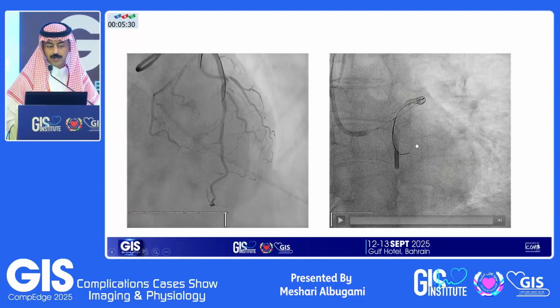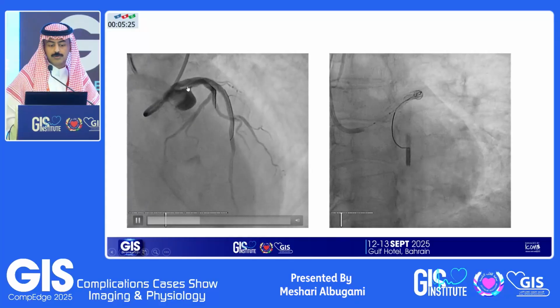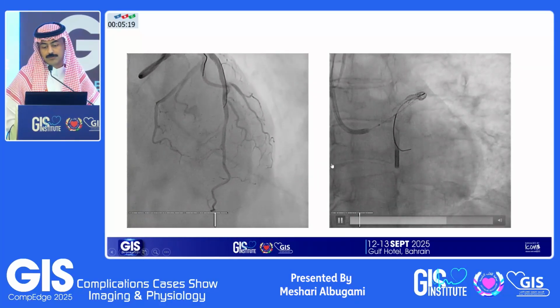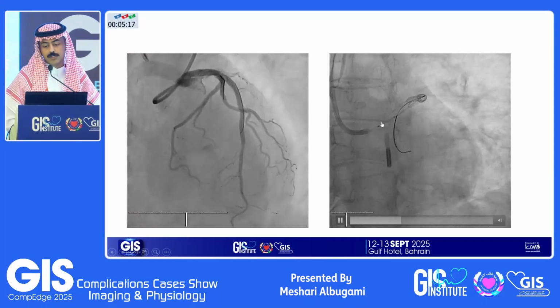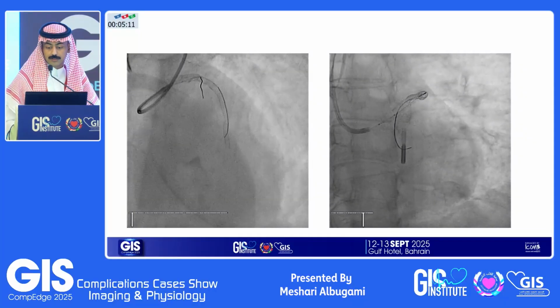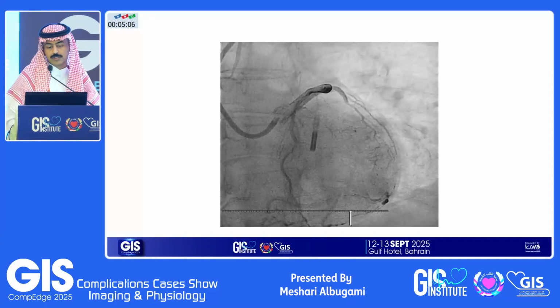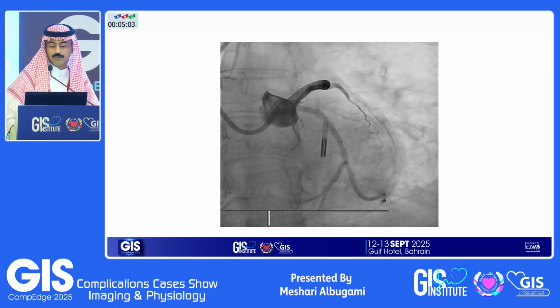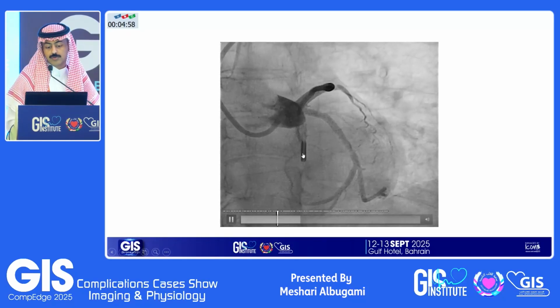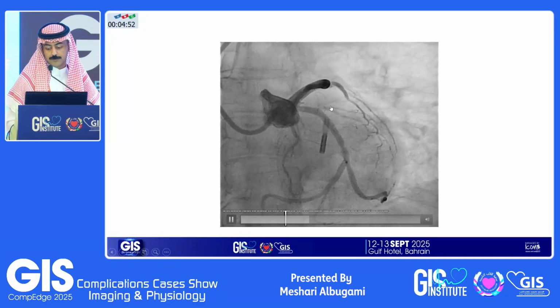Here is a coronary angiogram showing the flow in the cranial view in the LAD, and as you can see, there was a complete restoration of the flow to the LAD. Here, there was a final optimization of the stent in the proximal LAD, in case of longitudinal stent fracture. After that, we ended up kissing. Before the stent optimization here, we did kissing balloon inflation, and this is our final angiogram showing resolution of the proximal circ lesion and restoration of the flow to the LAD.